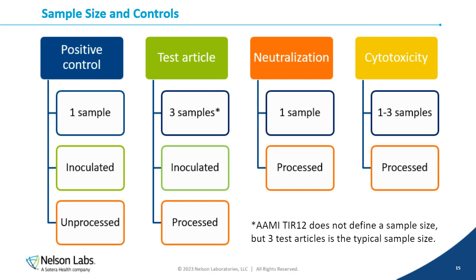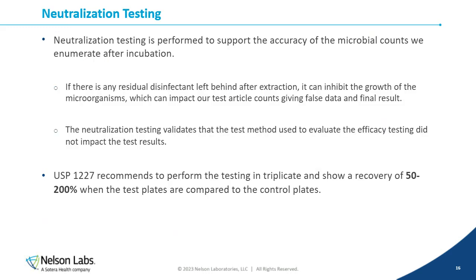Now, what is that neutralization test that I mentioned? The neutralization test is essentially a method suitability test. It is ensuring that we are neutralizing any disinfectant left behind after the extraction procedure.